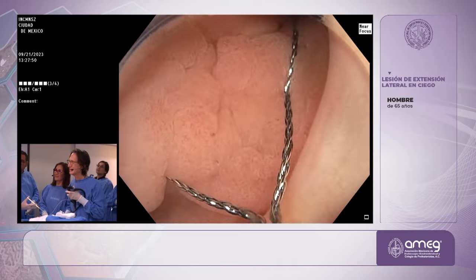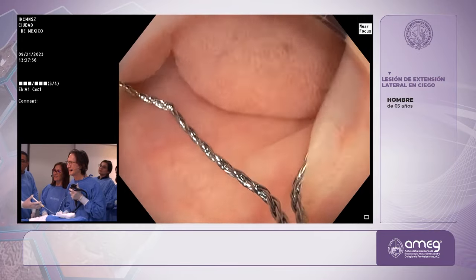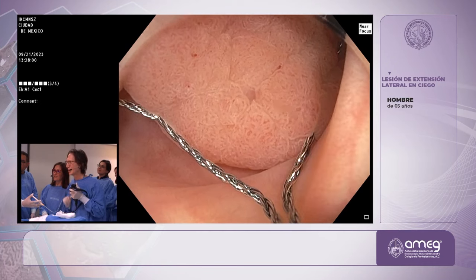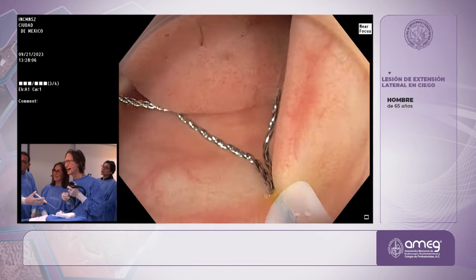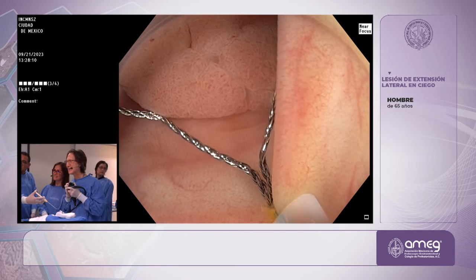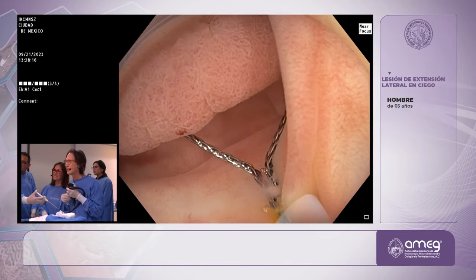Maybe, but jiggle a little bit. Try to scoop it. Slowly jiggling. All these maneuvers are helpful. Hold the scope here. I'm going to try to turn it this way, because a lot of times there's an over, and I'm going to rock back and forth a little bit. But if I can't get it to go to the right side completely, I'm just going to have to take what I can get. Look, it just went.